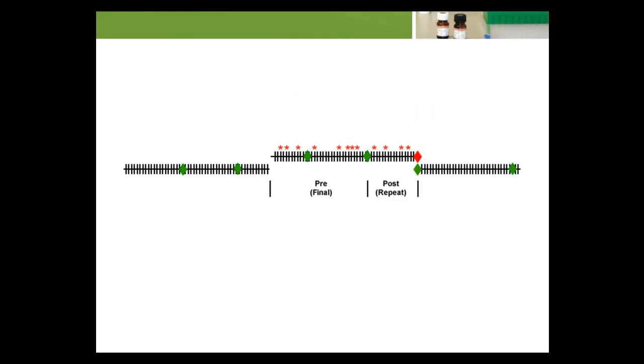While unreliable patient results were produced during the out-of-control condition prior to the last accepted QC event, a significant amount of time has likely passed, making them difficult to identify and correct. For all practical purposes, patient results produced prior to the last accepted QC event are final. However, the unreliable patient results produced between the last accepted QC event and the QC rejection are recent and should be regarded as correctable.